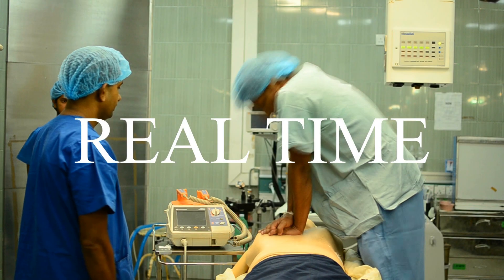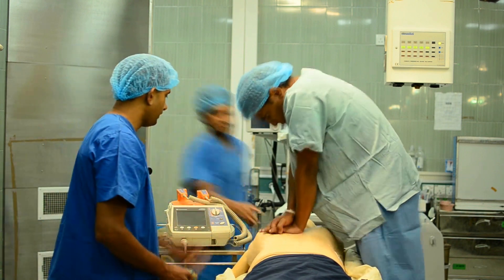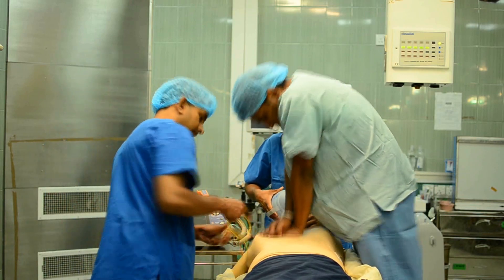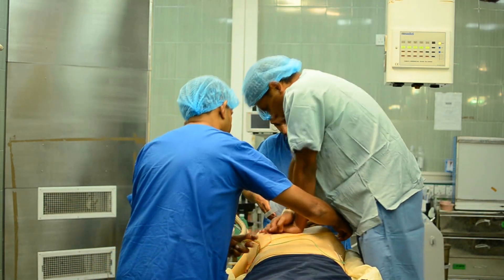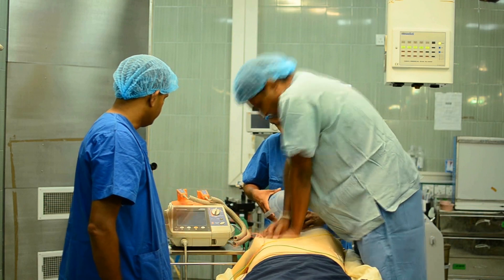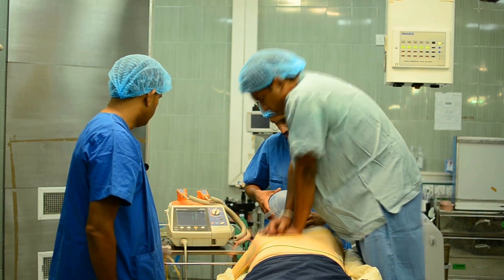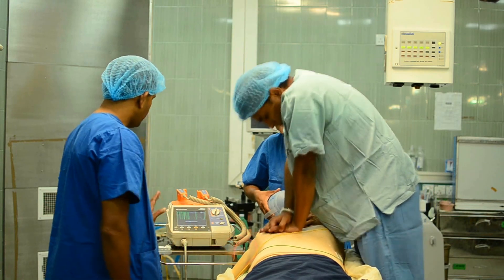Now we will be showing the same process in real time. It's a cardiac arrest. Please continue to massage. Please come and handle the airway — I'm connecting the leads. Switching on the monitor. Selecting lead 2 and selecting the sensitivity. Now the monitor is ready.